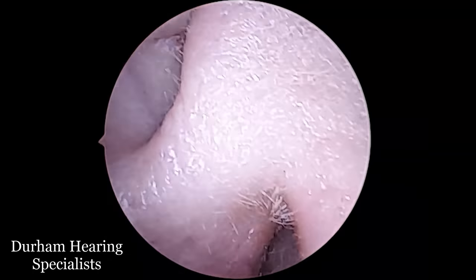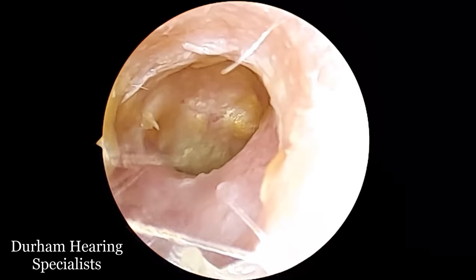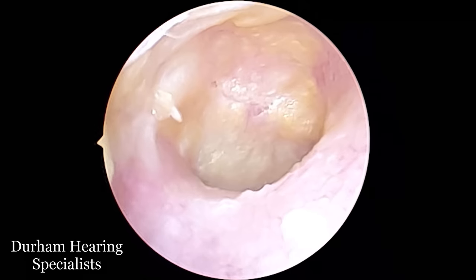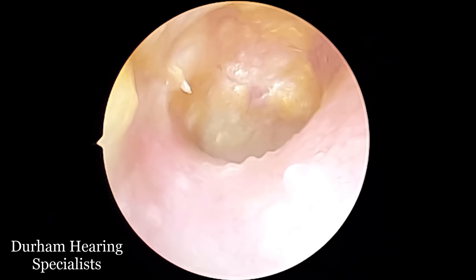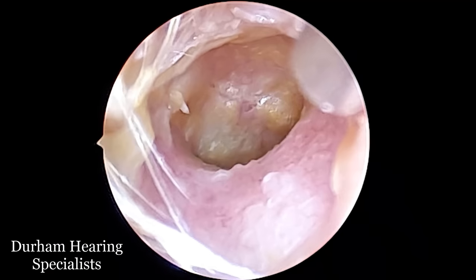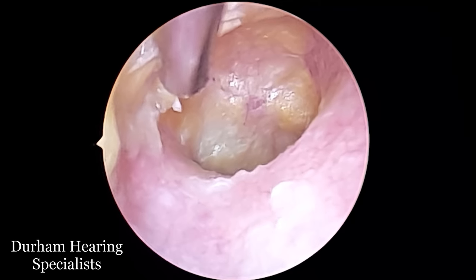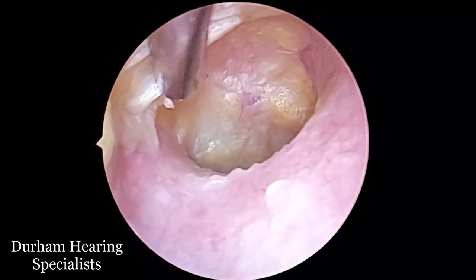So I'm going to go in again and capture it from the side — this bit is going to be in slow motion just so you can see it all come off. But instead of going directly central, I'm going to go in with the suction probe and just catch it on the left hand side, and you'll see a little bit of movement just as I touch it right there.